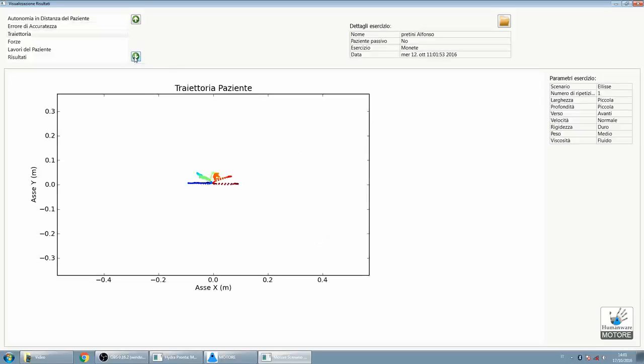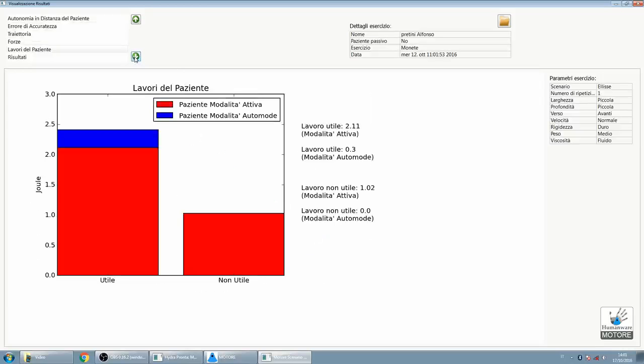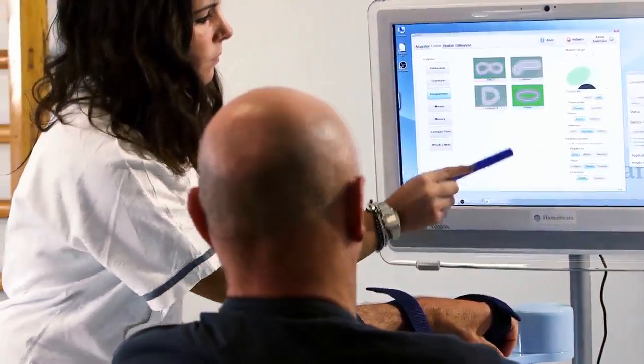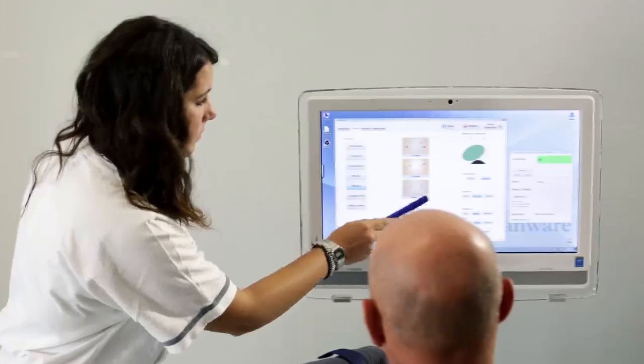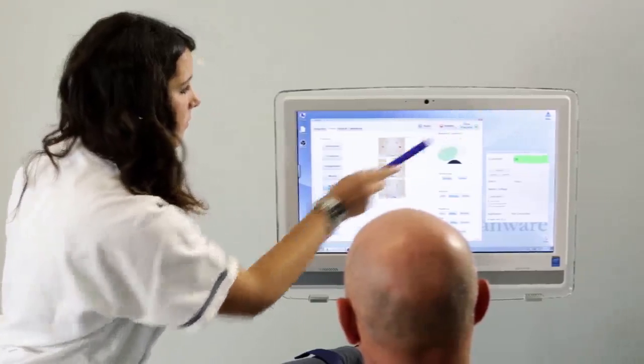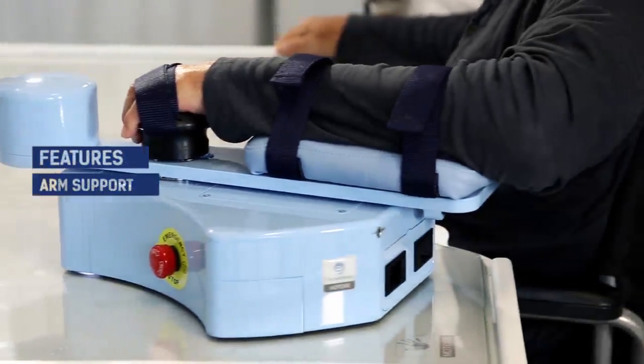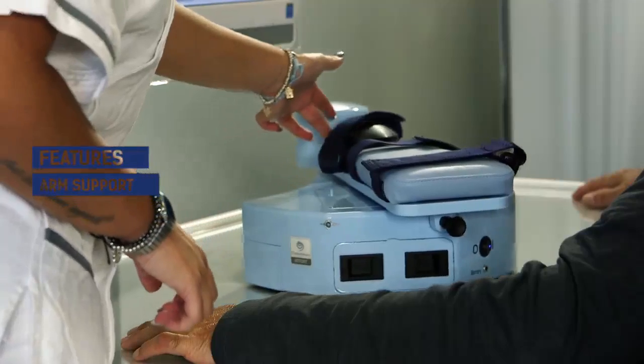Motore evaluates patient's upper limb performance and their progress. Hence, it is also a useful tool for clinicians and therapists. It has dedicated software with several exercises which allows the therapist to choose the best rehabilitation protocol for each patient. Motore supports the weight of the arm, which makes the rehabilitation process easier.